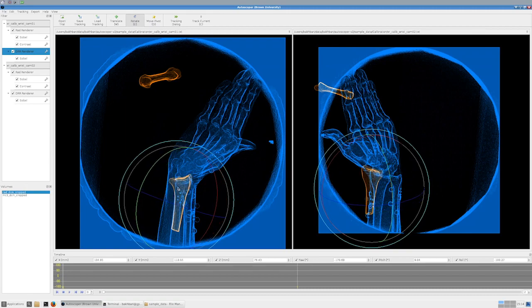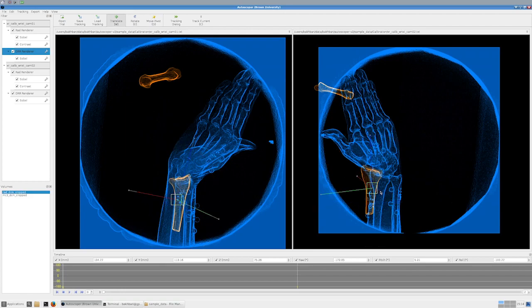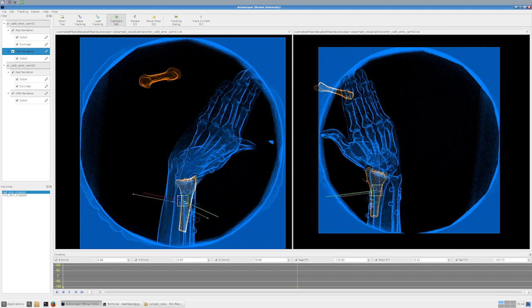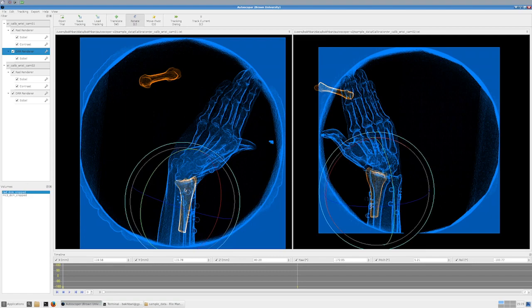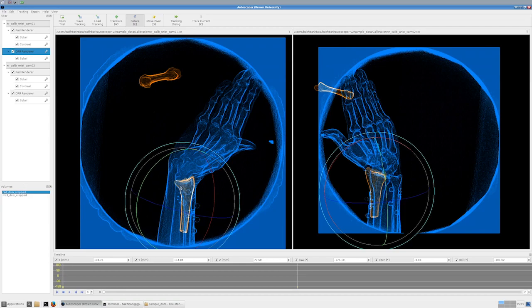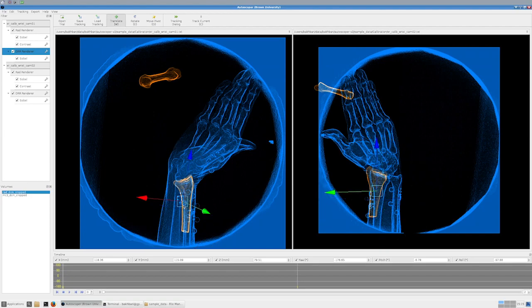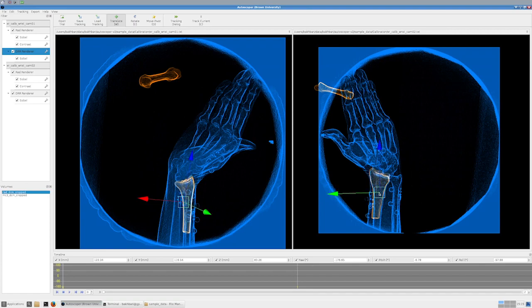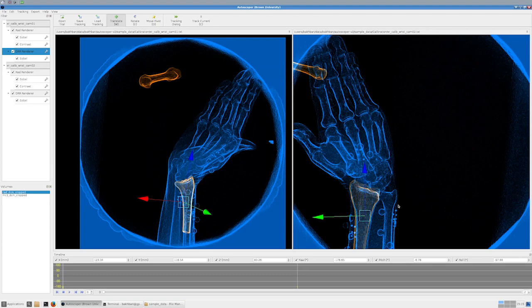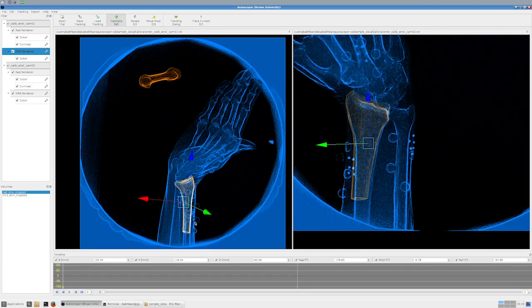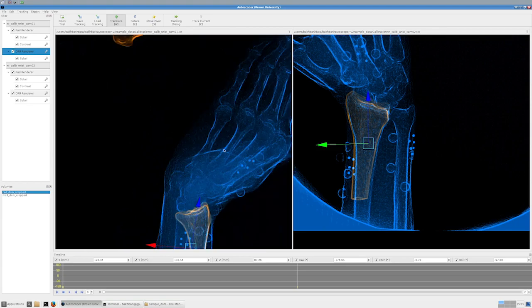I'm doing some rotation and translation to get the radius to where it should be. Understanding how bones look in space based on the radiograph gets better the more you work with them. Because we're working in 3D, every change in one camera view updates the other as well. The initialization is close but not perfect yet.